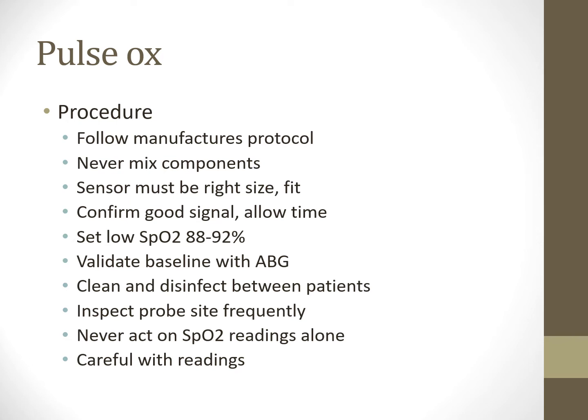So that's something where we just got to make sure we're not causing too much pressure from it being on the site. We'll change it from time to time. That's just something to make sure, and that avoids things building up underneath it. It's pretty nasty if you don't change the site.